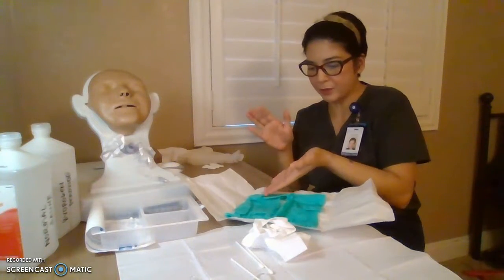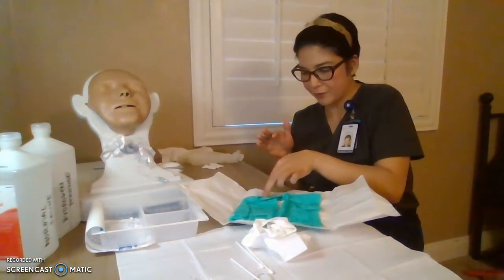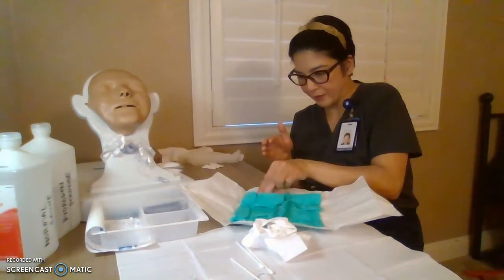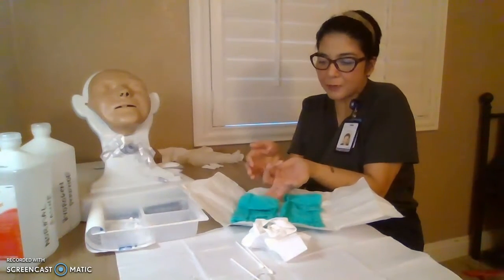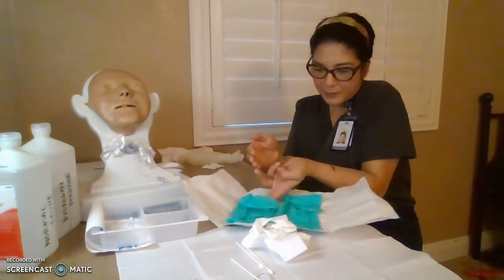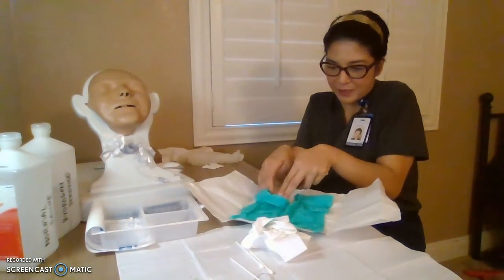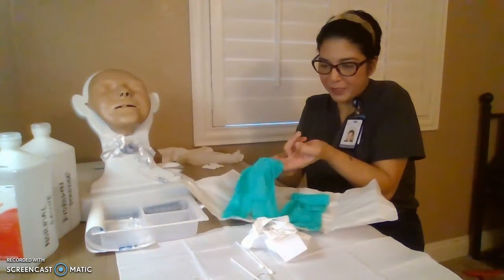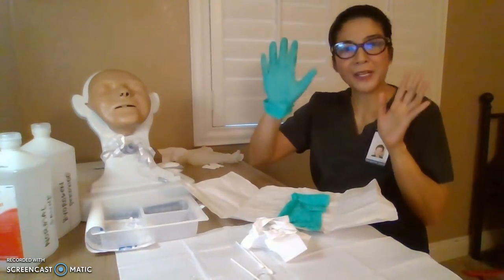So what I'm going to do is go inside the cuff. There we go. I'm making sure I'm not touching the outer part of the glove. So now I'm going to maneuver my hand in. There we go. All right.